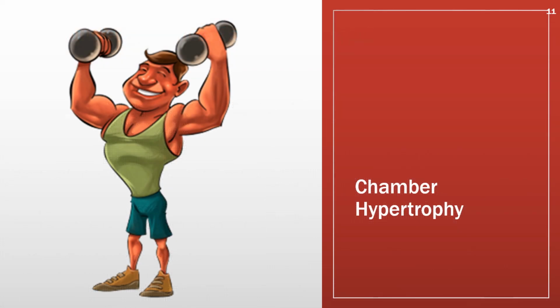Now we're going to talk a little bit about how chamber hypertrophy can have an effect on precordial transitions or rotation.